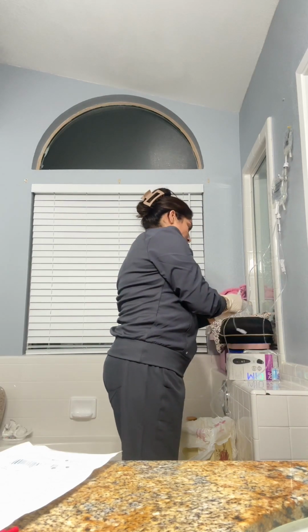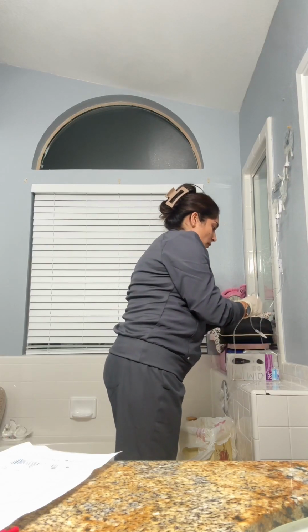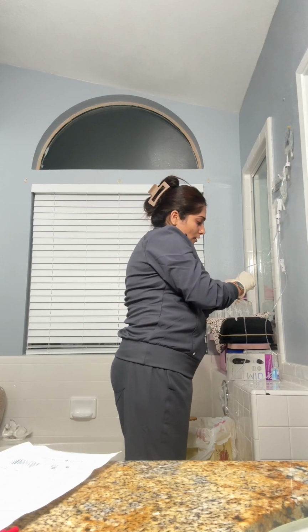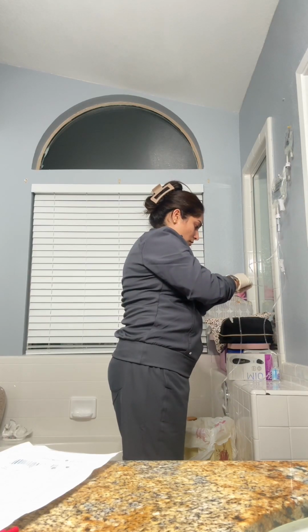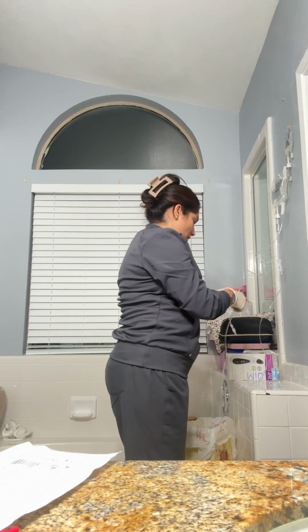And we will be connecting this, and we have already cleaned the site with an alcohol swab. Connecting this right here.